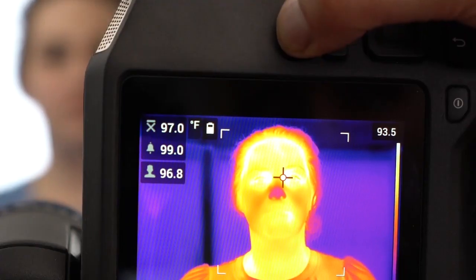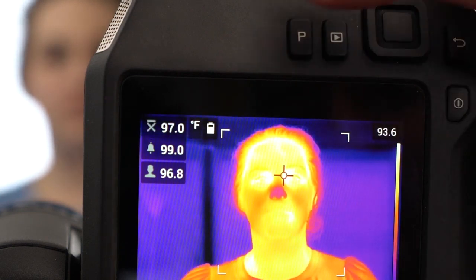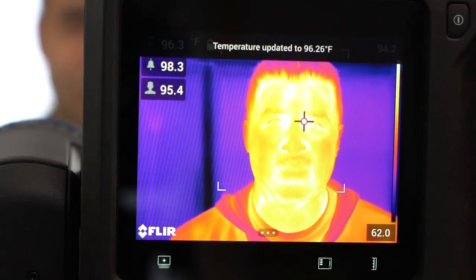A long press of the P button resets the baseline temperature. A short press of the P button averages in a new sample. It's recommended to average at least 3 samples from healthy individuals. The camera can store up to the last 10 samples.